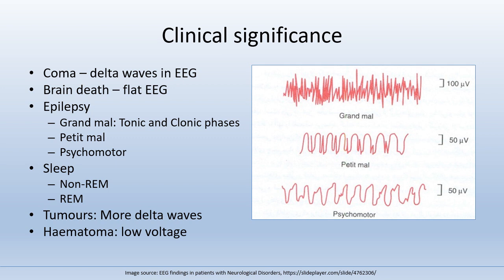During sleep, a lot of work on EEG has been done, and EEG has been extremely useful to study and research sleep disorders. There are two types of sleep, which is non-rapid eye movement sleep and rapid eye movement sleep. During these two types of sleep, we have various wave patterns. And study of these wave patterns has given us good insight in curing and treatment of different disorders.